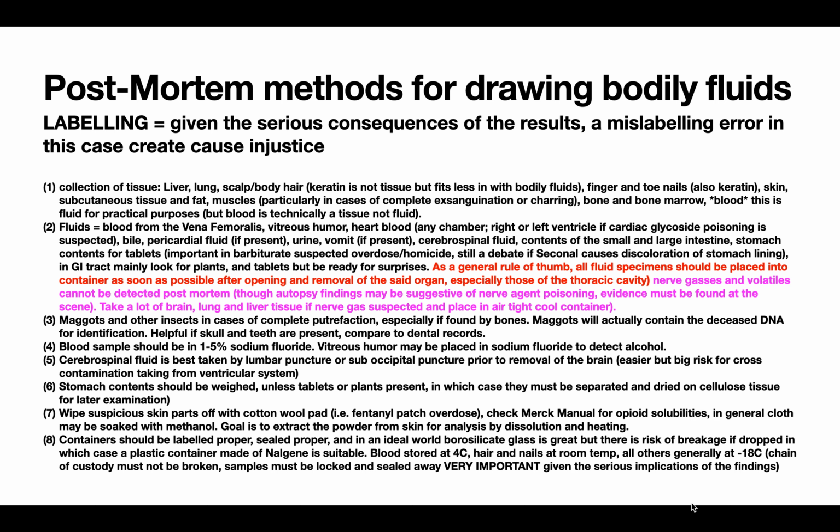You can really find anything. Weigh all of it if it's homogeneous, and take the non-homogeneous substances out for inspection.